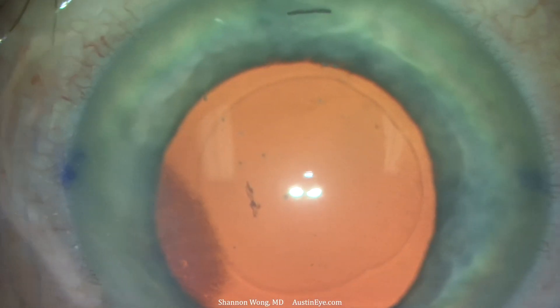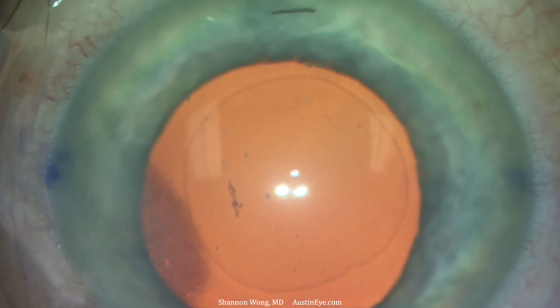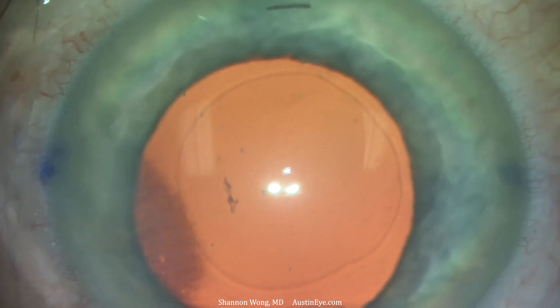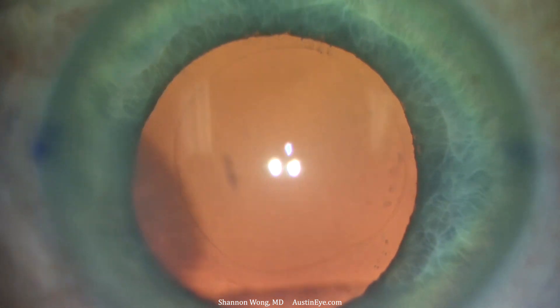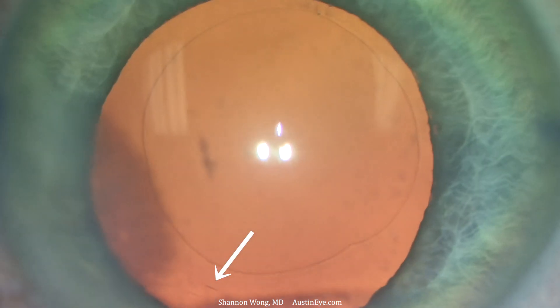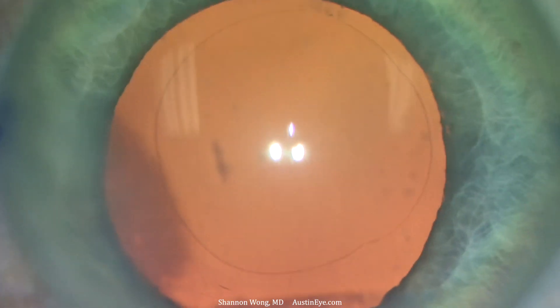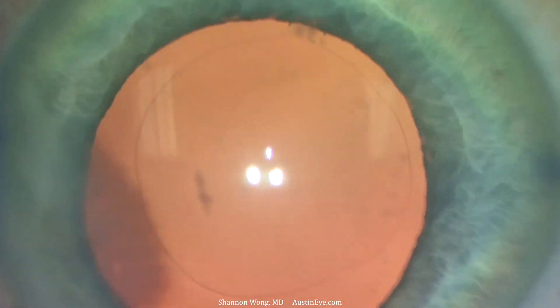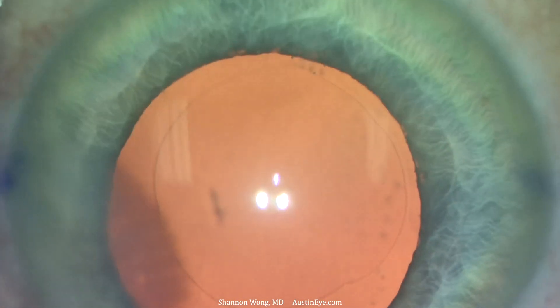We see that the femtosecond laser did not cut the capsule at all. There might be one tiny splinter of the capsule that was touched by the laser, but overall the LensX laser missed the capsule entirely.